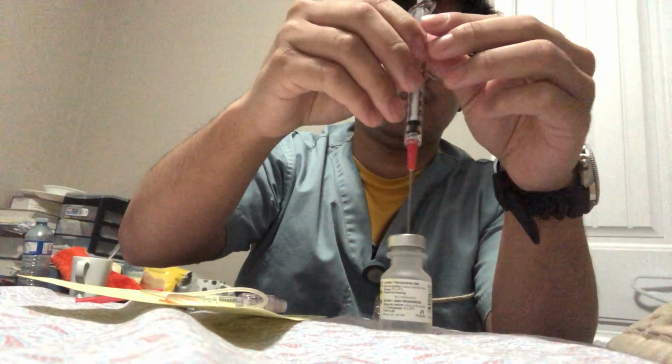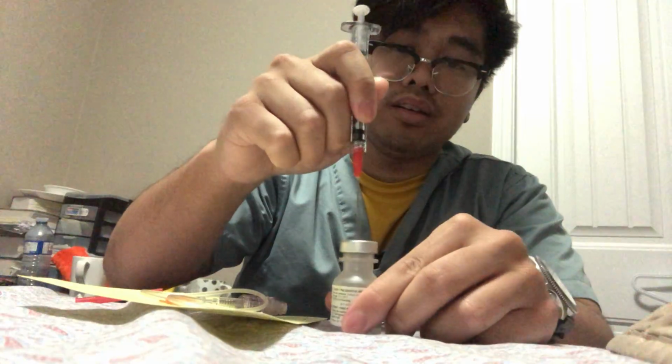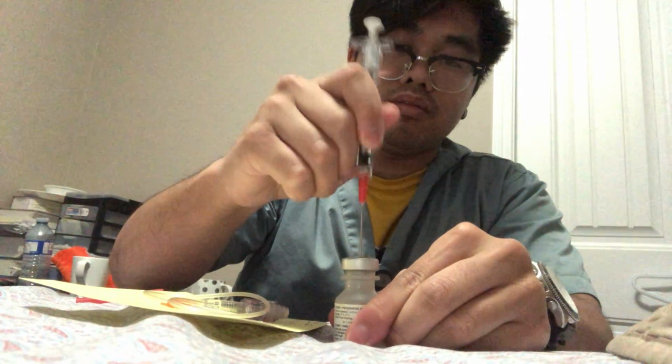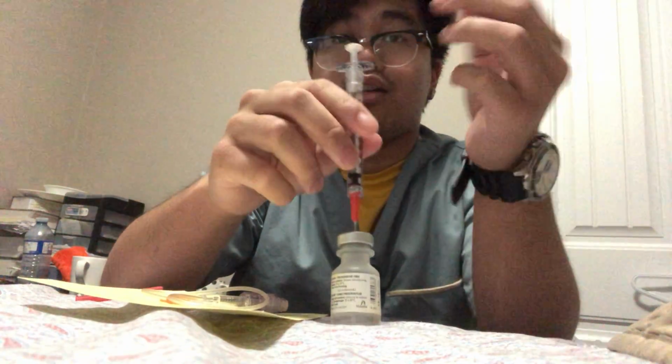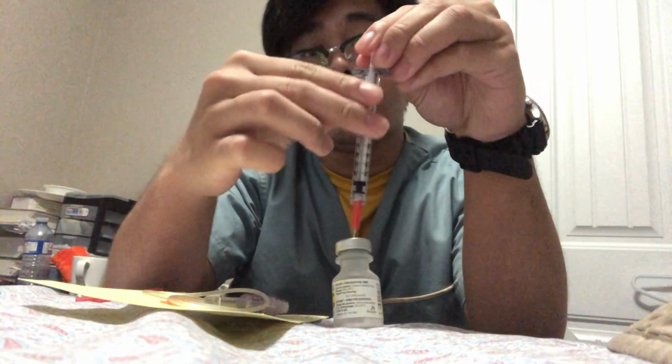By doing this, I'm doing the sideway technique to open this. I'm gonna put this in here. I'm just gonna hold it because I'm doing this on the bed. Now that I've inserted it, I'm gonna pull this up.